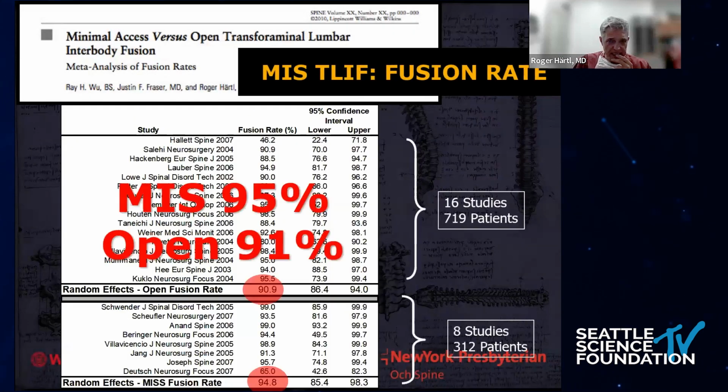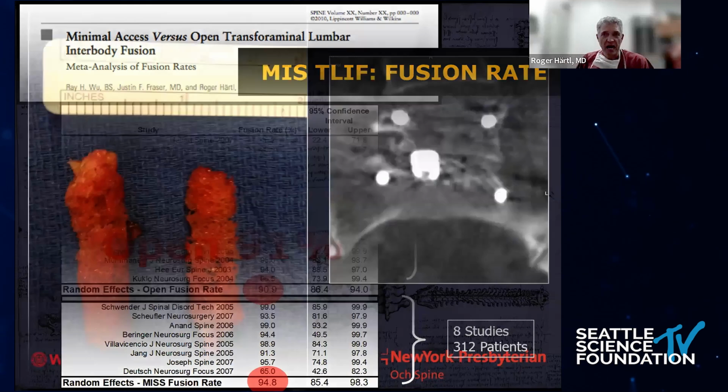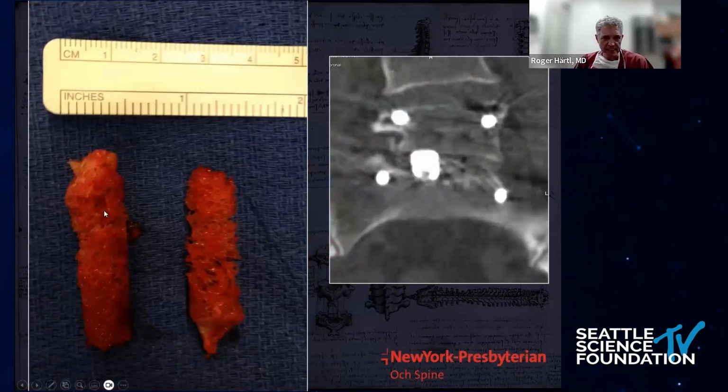Now, this is the paper that I mentioned before. Even 13 years ago, if you looked at the published results, the fusion rate with MIS TLIF was 95%. However, about 50% of these authors used BMP, and I think that it is not necessary to use BMP in every patient if you prepare the end plates, use autograft bone, and really spend a lot of time with the discectomy. I sometimes use iliac crest bone in these patients, but I always use autograft bone from the facet joint.